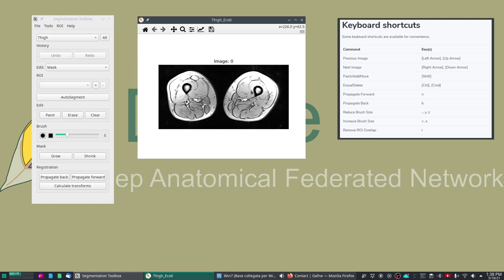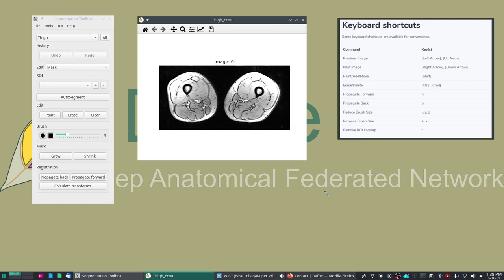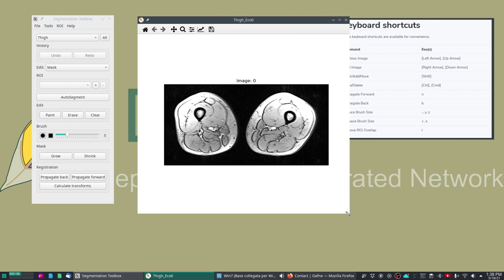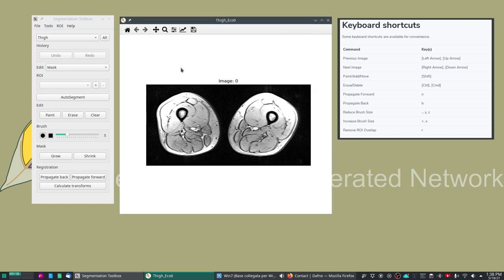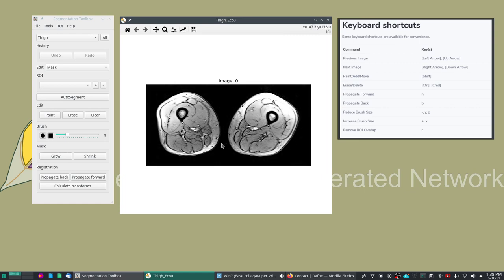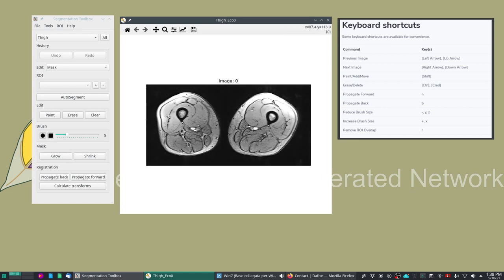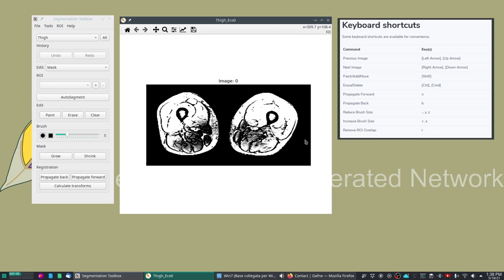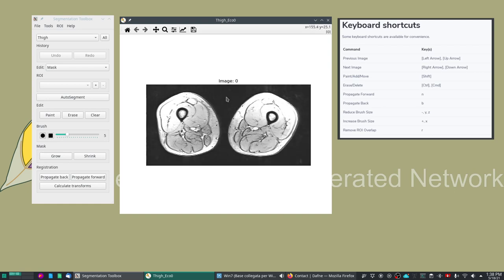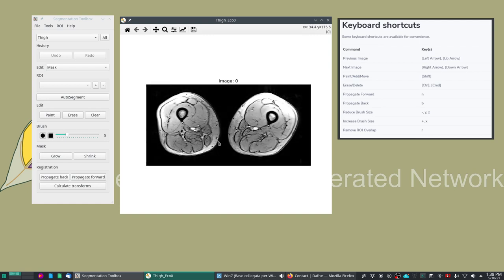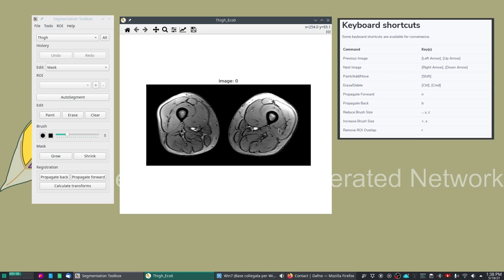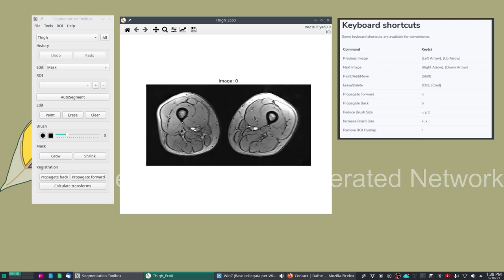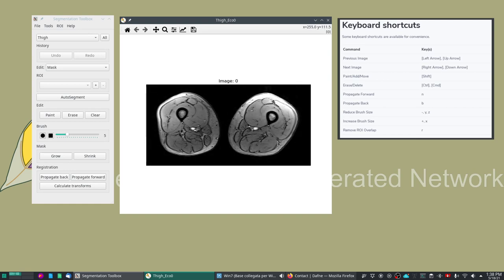This is the loaded dataset. We can increase its size and we also have the possibility of changing the windowing by using the right mouse button. Left-right changes the contrast and top-bottom changes the brightness so we adjust it to a comfortable windowing level.